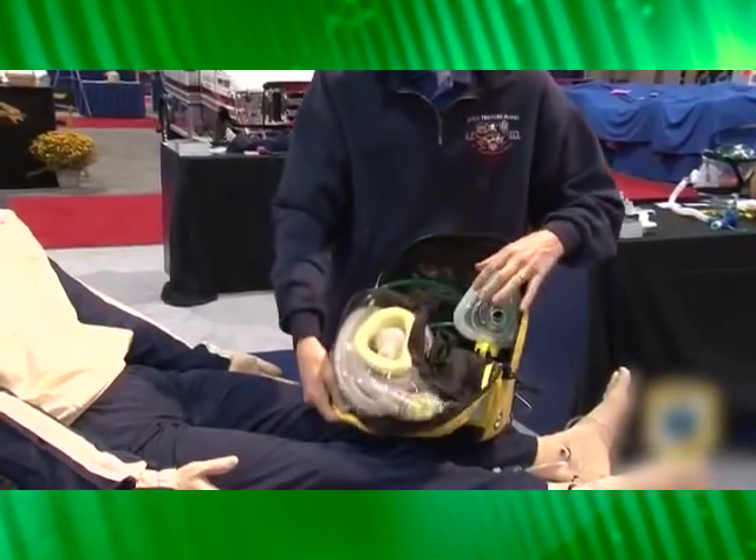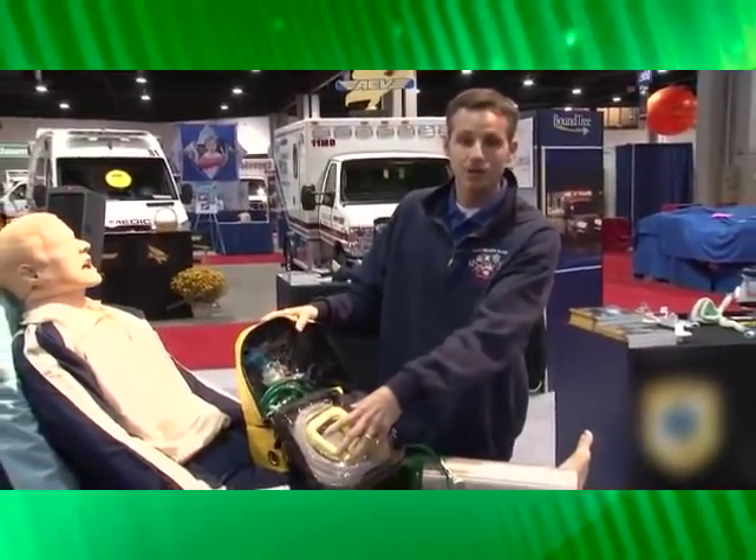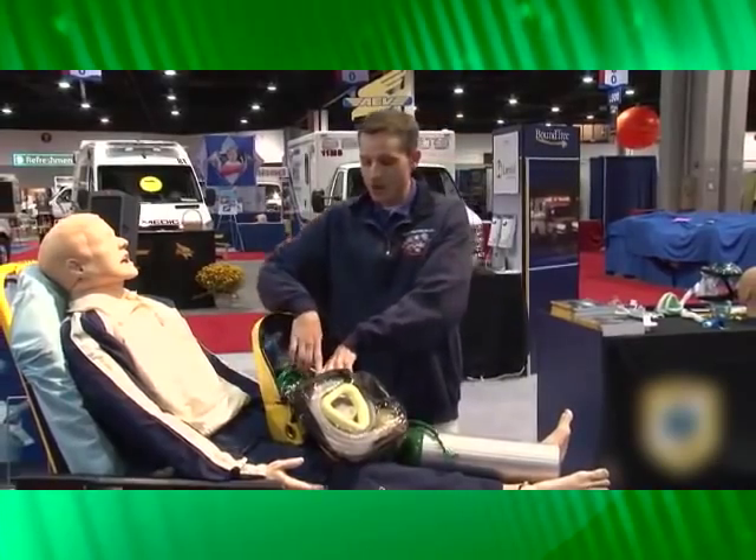Hi, my name is Tom Cronin with Emergent Respiratory Products, and I'm here today to talk about the PortAvent CPAP system. In your kit you have your mask, your disposable circuit, and your drive unit.